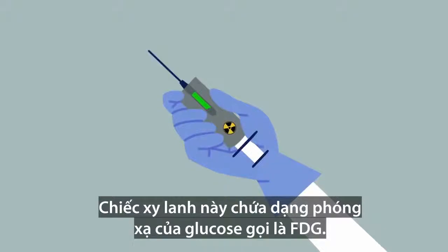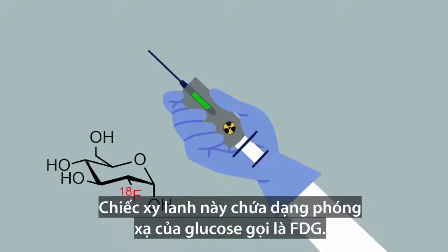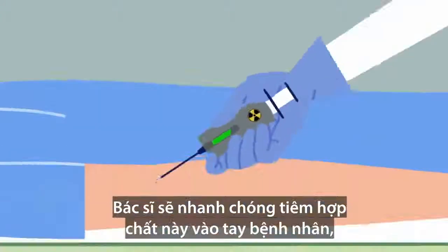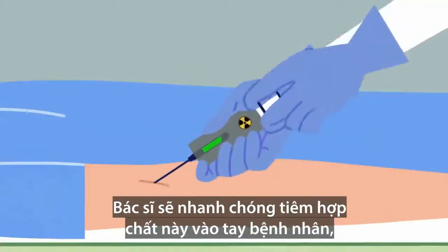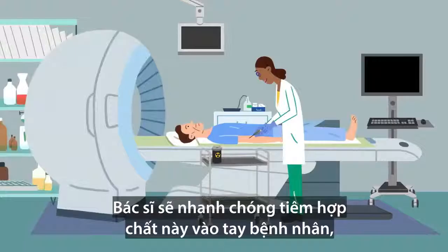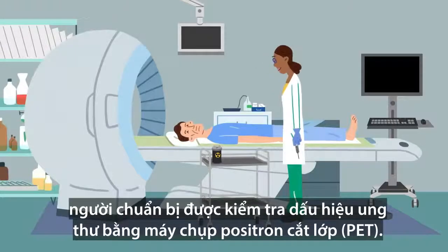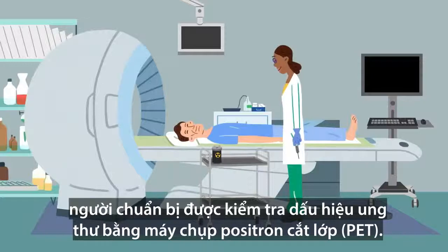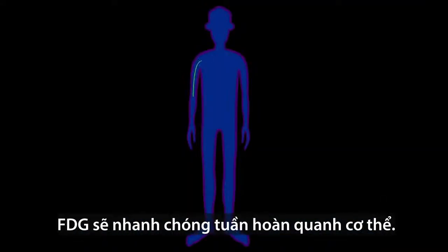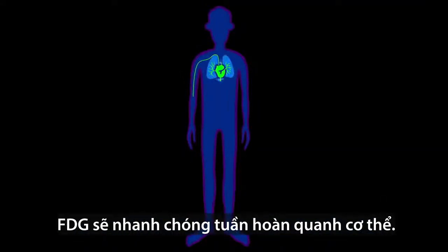This syringe contains a radioactive form of glucose known as FDG. The doctor will soon inject its contents into her patient's arm, whom she's testing for cancer using a PET scanner. The FDG will quickly circulate through his body.